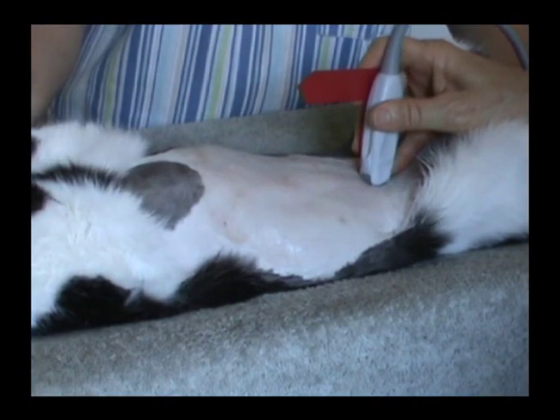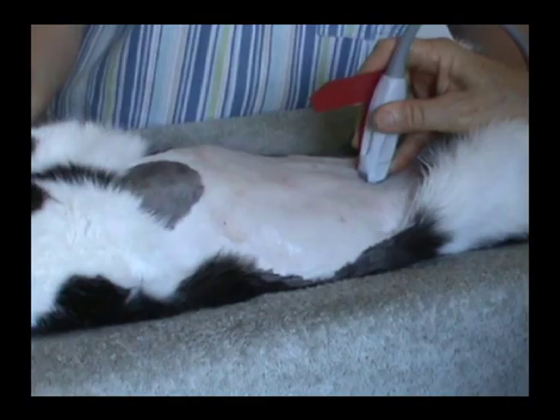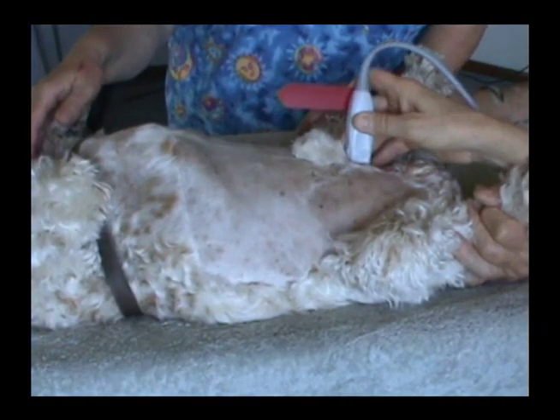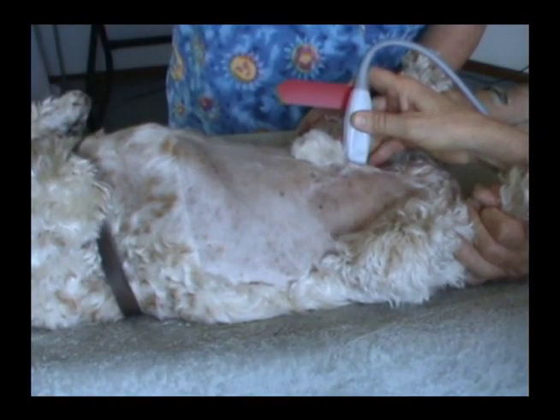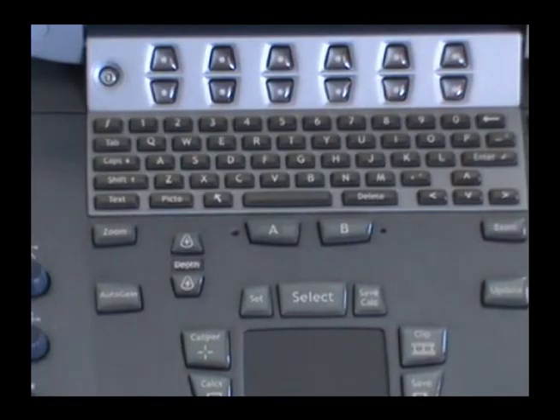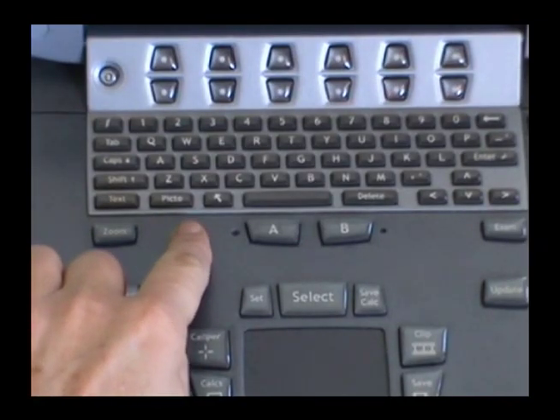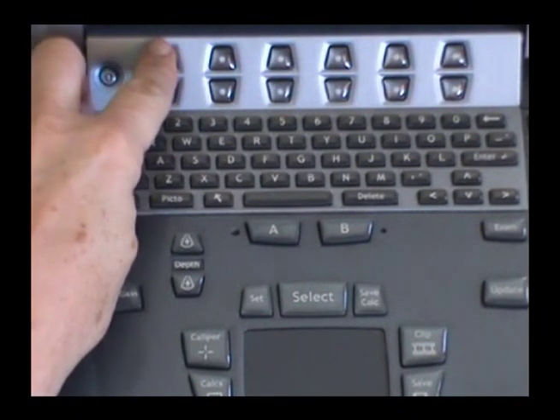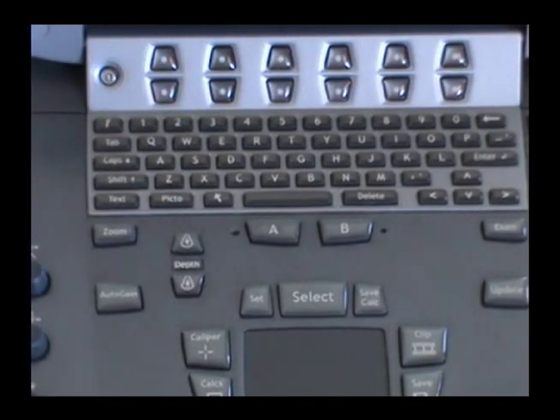Remember to keep the organ centered on the ultrasound screen to reduce artifact. This is best accomplished by holding the transducer perpendicular to the patient's body and the organ of interest. Adjust depth to fill the ultrasound screen with the organ of interest. If needed, adjust transducer frequency for the current depth. Adjust gain for the best image. And adjust focal points to the bottom of the organ of interest.